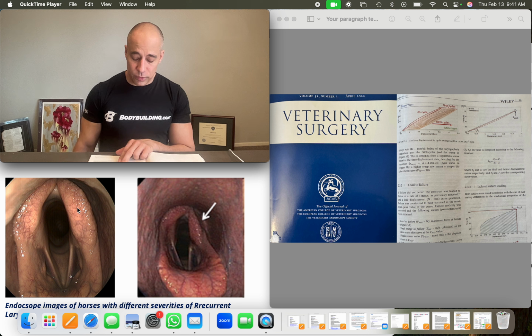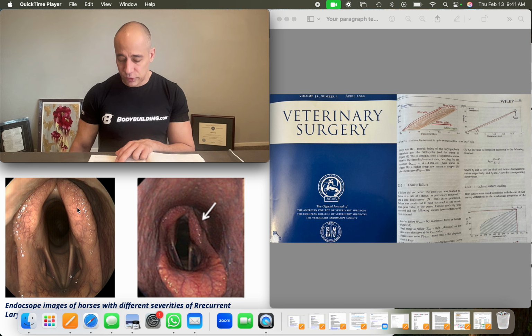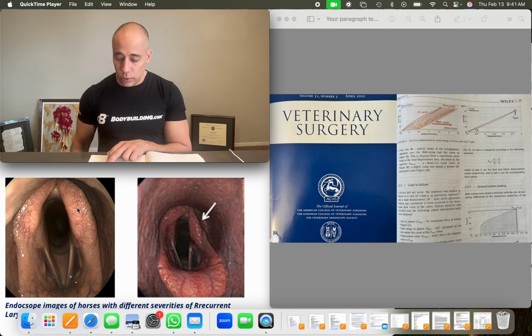After cyclic testing, the total migration and creep were lower in the cannula tiger tape group. The numbers they give here are 6.36 millimeters and 1.35 millimeters per second. Those numbers were lower than the Ethibond group, which is 11.12 millimeters at 3.39 millimeters per second, and the tiger tape group at 11.26 millimeters and 3.2 millimeters per second. So that's how much displacement and how fast displacement occurred under testing. They found no difference with the Ethibond cannula group at 9.19 millimeters and 2.14 millimeters per second. A correlation was found between total migration and creep, meaning that the more migration there was, the more creep there was, and vice versa.